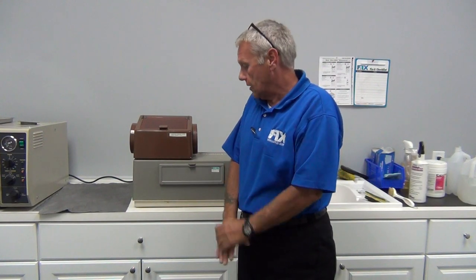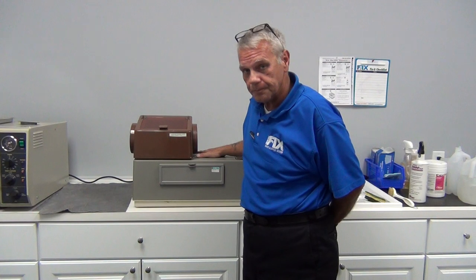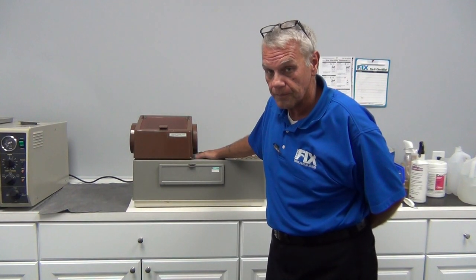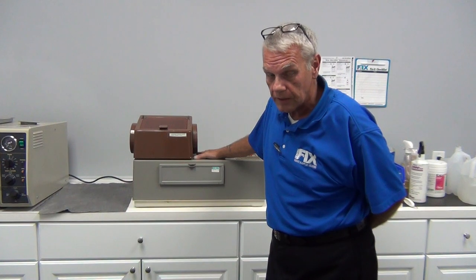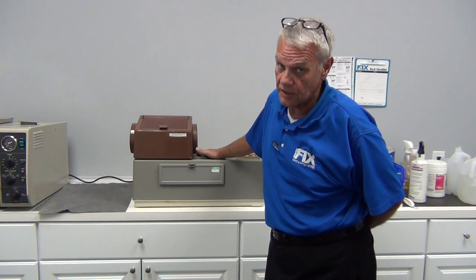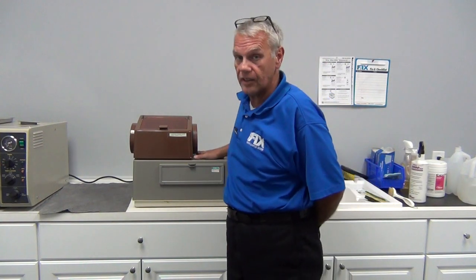Today we're briefly going to go over the maintenance on the Perrier Pro processor. As we all know, the Perrier Pro is a rollerless style processor. It's unplumbed, it's an easy processor to maintain, it's an easy processor to repair. We're going to do a repair video at a different time for this, but right now we're concerned with maintenance.